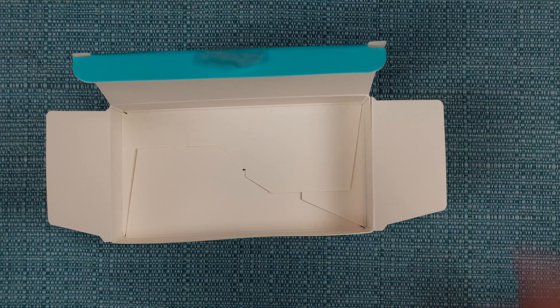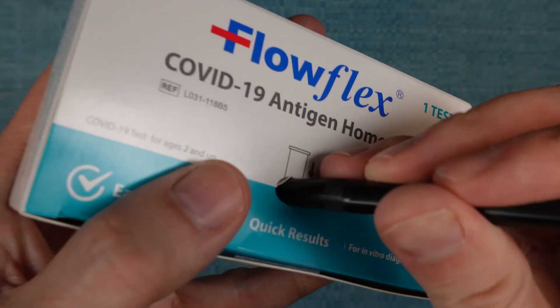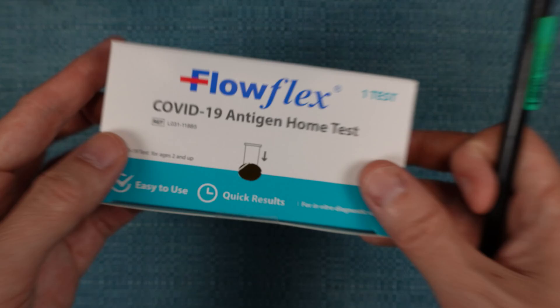Empty the contents, then close the box, then perforate the hole on top of it with a pencil or something.